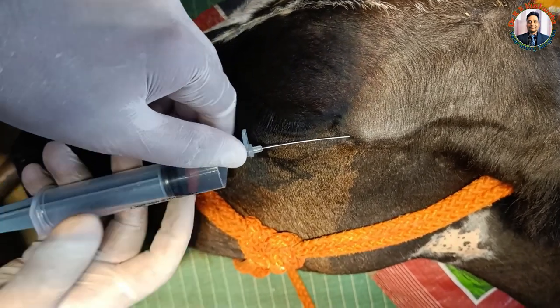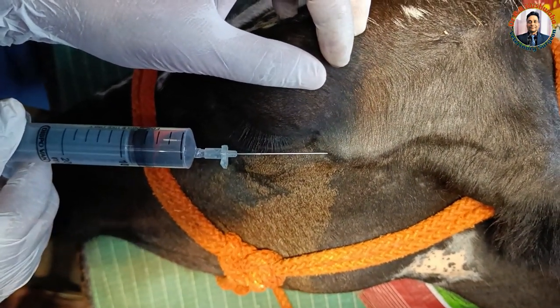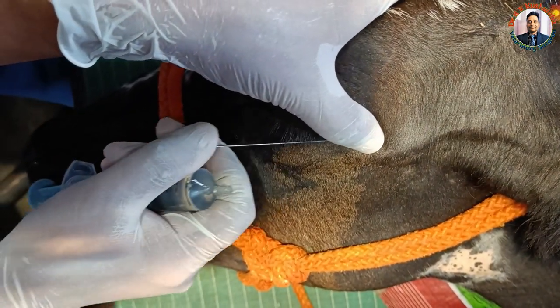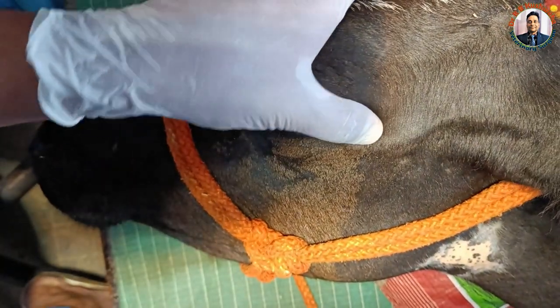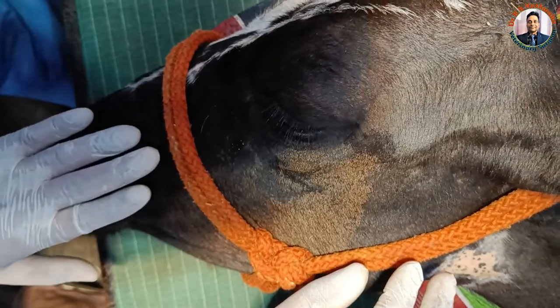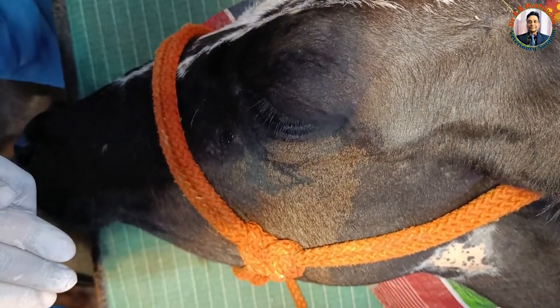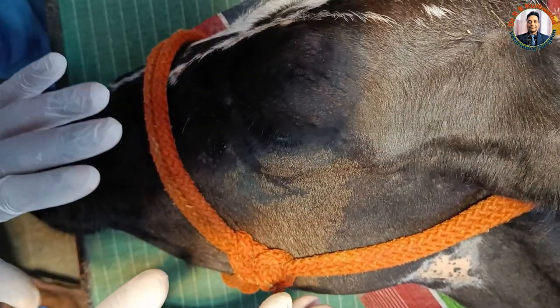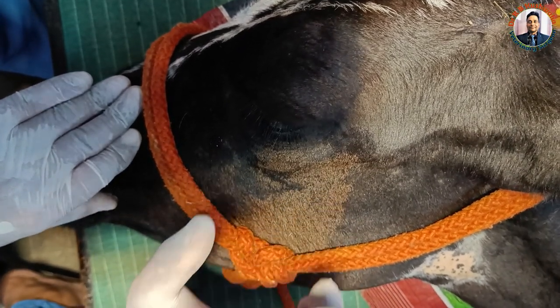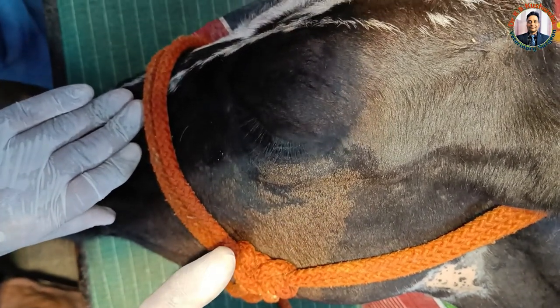For the auriculopalpebral nerve block, 5 ml is sufficient. Then gently remove the needle and wait for a minimum of 10 to 15 minutes. This is how you induce the auriculopalpebral nerve block and the Peterson nerve block.